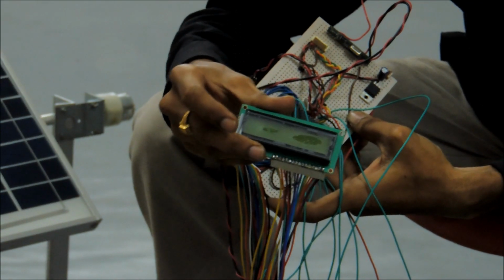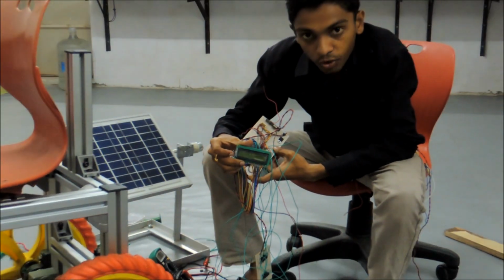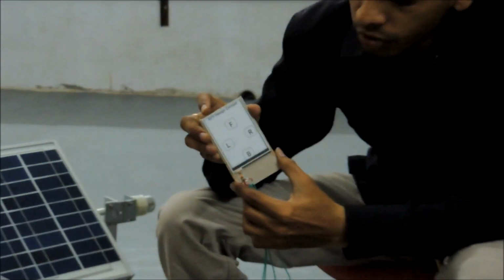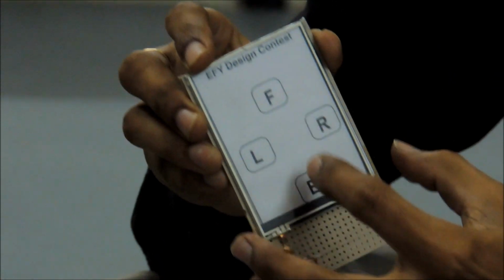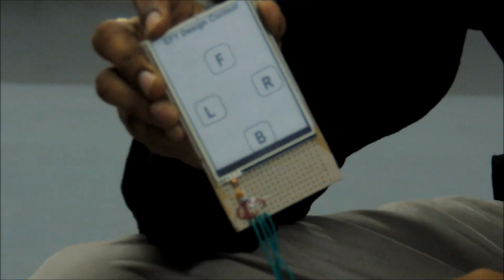We have an LCD here, which shows the direction as well as the battery and the mode of operation. We have two modes to control the wheelchair. The first mode is touchscreen mode. This touchscreen consists of four buttons, nothing but the x-axis and y-axis. We are reading this with the help of the ADC in our program.